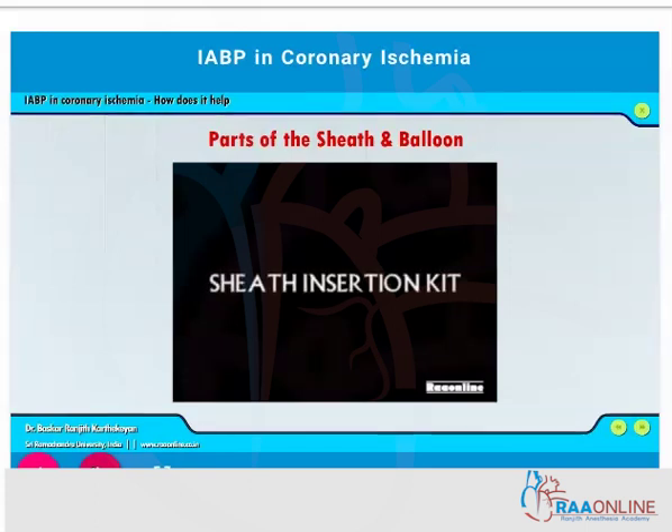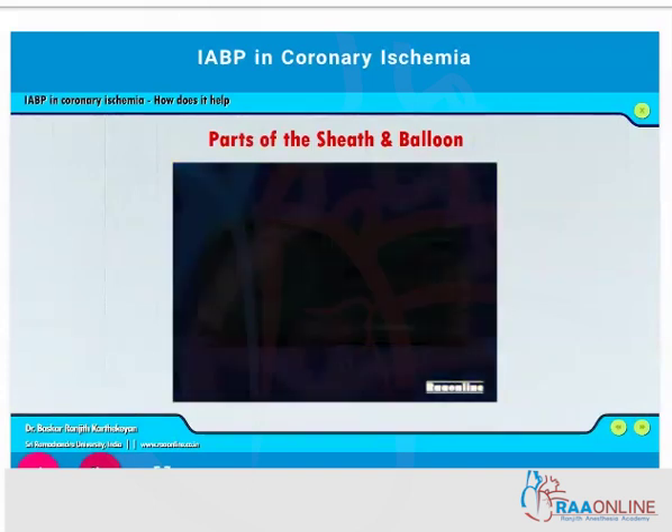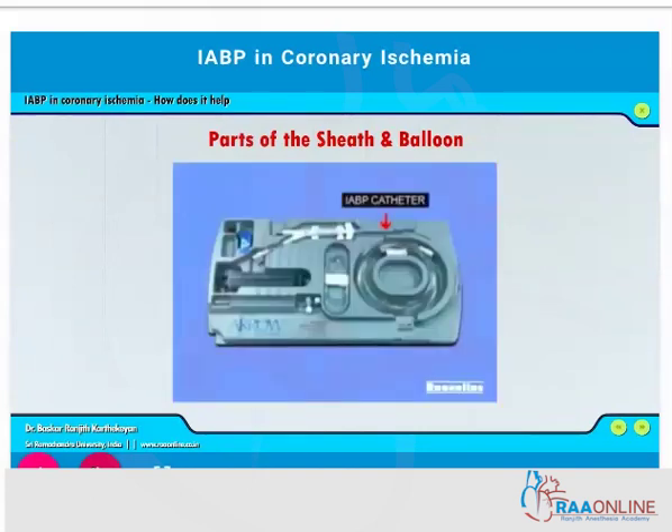This is how the sheath insertion kit looks like: you have a sheath with a dilator, then a dilator alone — multiple dilators in different sizes — then there is a needle for puncture, the knife, and the guide wire.